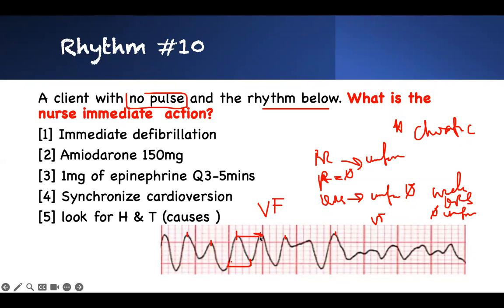The heart rate is very fast. And you see the ventricle basically doing its own thing. It's not uniform. It's like all over the place. It's wide, wide. So these are sometimes the easiest things to describe it without giving you an EKG. So you look at them. Wide QRS complex that is not uniform is a VFib. See, with the very fast. So what is VFib? Well, the heart is quivering. This one is dangerous. It's one of the lethal rhythms.